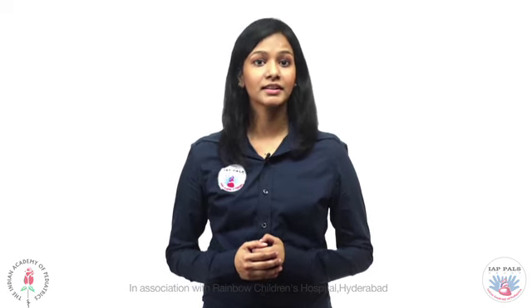Now, let us see how an automated external defibrillator works. The advantage of an AED is that you don't have to worry about recognizing a shockable rhythm. All you have to do is start the machine, attach the pads, and stay clear of the victim so that the machine analyzes the rhythm and assesses whether the patient needs a shock or not. After a few seconds, the machine will reveal whether the rhythm needs a shock or not. If the rhythm needs a shock, you will be required to press the shock button and the shock will be delivered. Let us now summarize the steps to operate an AED.